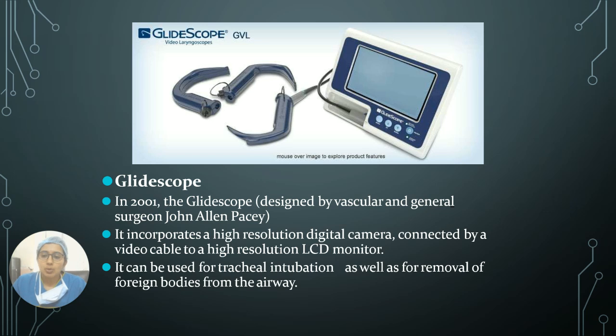GlideScope. In 2001, the GlideScope was designed. It incorporates a high-resolution digital camera connected by a video cable to a high-resolution LCD monitor. It can be used for tracheal intubation as well as for removal of foreign bodies from the airway.